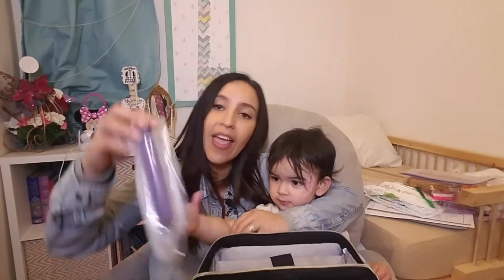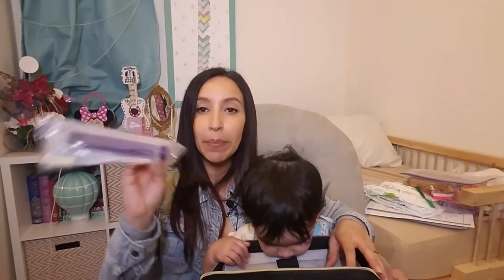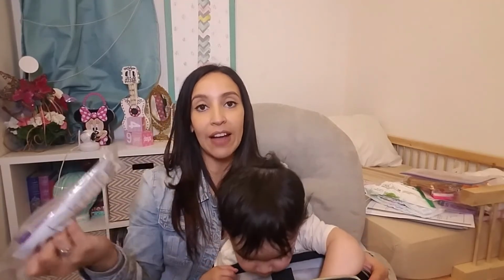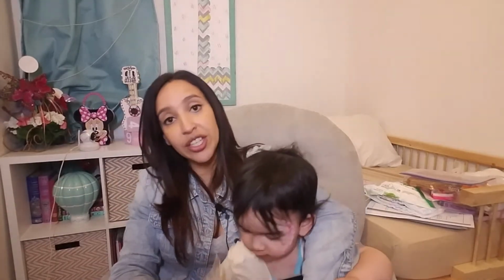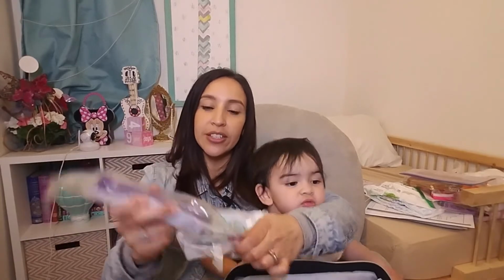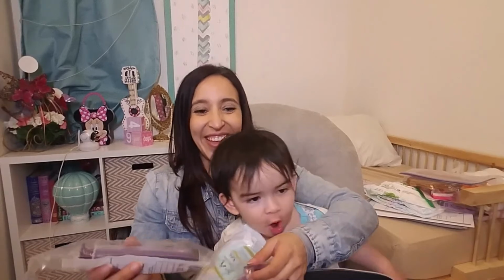And then I bring one of these with me. Let's show the camera. This is a big syringe, and if worst comes to worst, let's say that my Joey pump ran out of batteries and I have to feed Kaidynce, this is a syringe where you can feed her through the syringe. You just hook up the extension, which is this, to her belly, and then you get the formula into the syringe, and then you could put it together. And then you could feed her that way.